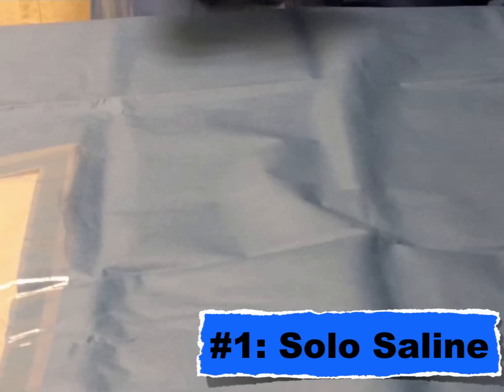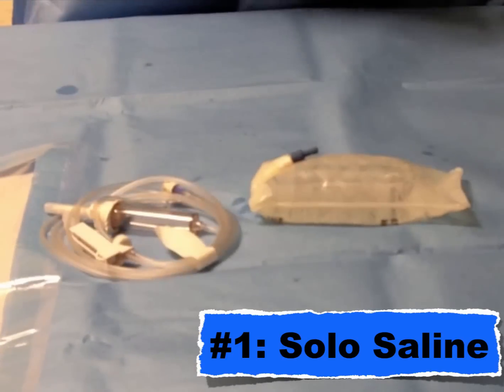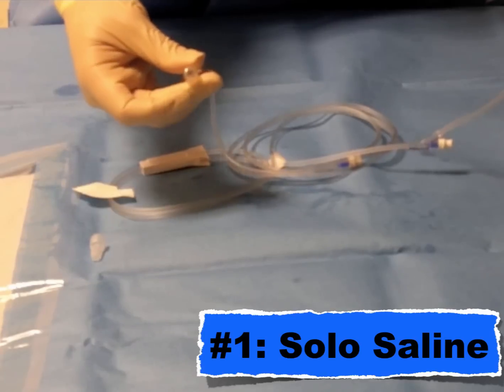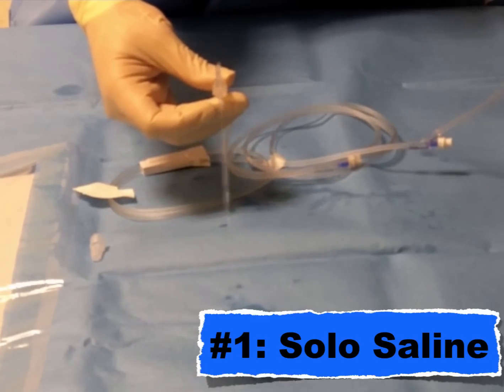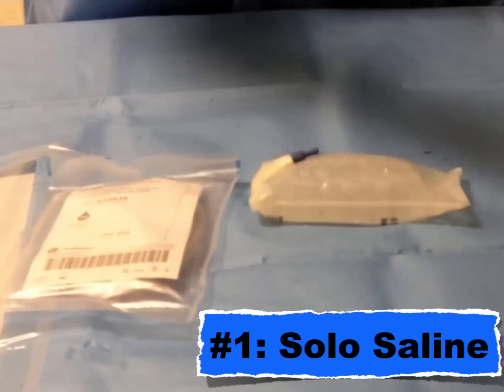The final tip for placing a central line is what to do when you're all by yourself. Some kits will have prepackaged sterile saline flushes, some won't, so you'll have to depend on someone at the bedside putting sterile saline into your field. Here's a trick I learned during residency: get saline and some tubing — these are sterile within their containers — open up the bag and the tubing, put it sterilely on your field, spike your bag, then hand your bag off to somebody to hang up. Now you have a continuous supply of saline on your field, and you can even connect it to your central line after the procedure. Use this technique to be much more self-sufficient.